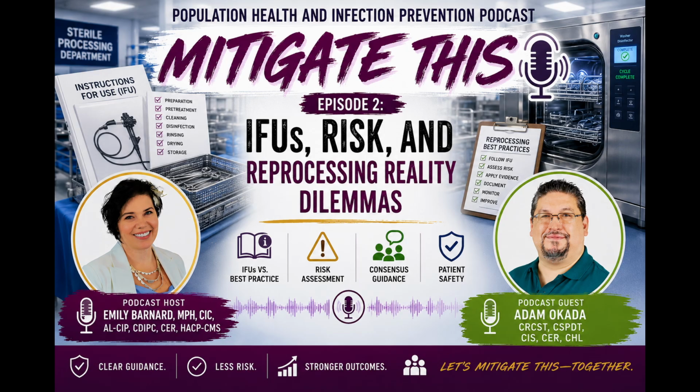Yeah, I think that's definitely a good point you're making. With the cleaning instructions and things like that, I remember one facility where we had a lot of different kinds of flexible scopes. We actually looked at all of the IFUs. What do all the IFUs say? What is the soaking time? What does the brushing say? And we created a process for our minimum standards so that we were meeting all of the IFUs with one standard work, if you will. So we have done things like that in sterile processing, but it really takes looking at all those instructions, combining them, and then figuring out what is the best thing for your facility.